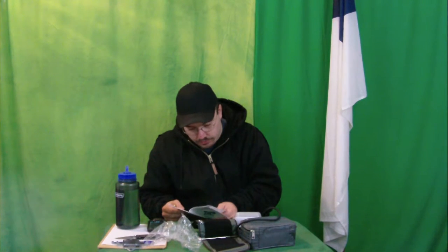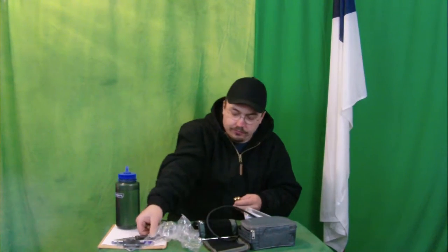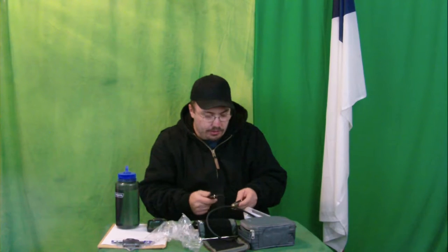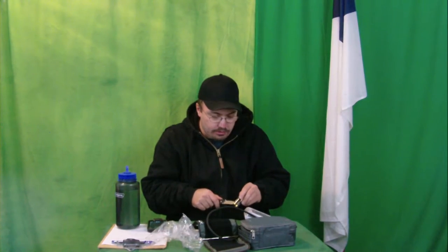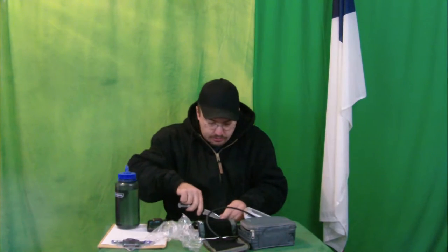It's got a power supply port — six volts DC. So you can plug this into power if you want to, which is a cool option. However, it does not come with the power adapter to do that. But it is a pretty cool option to be able to do that.